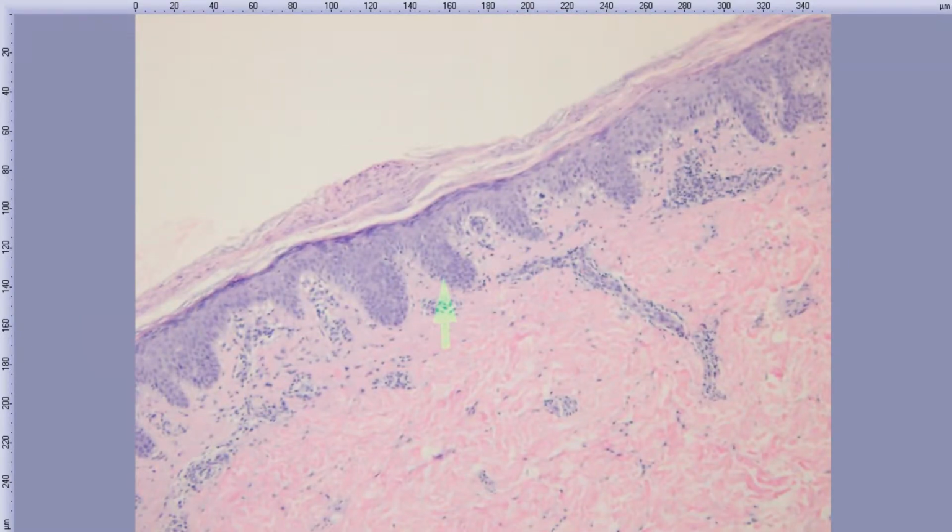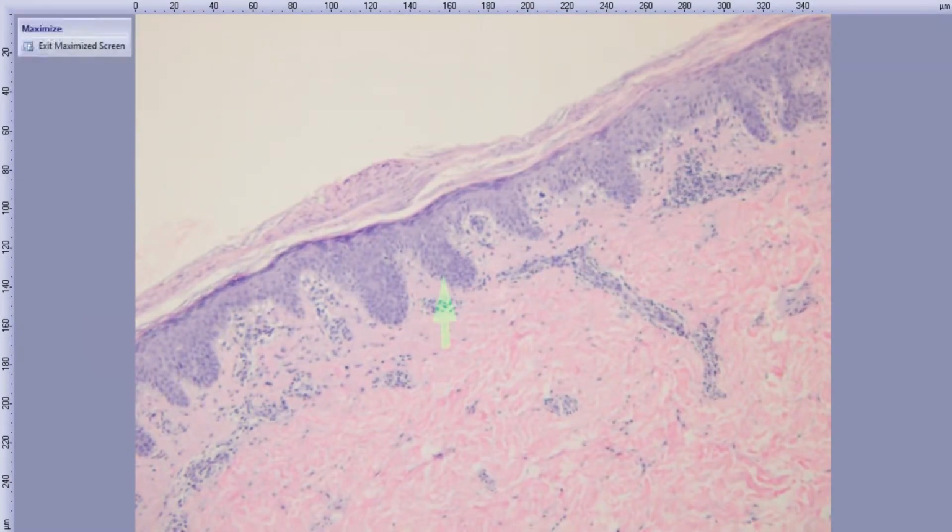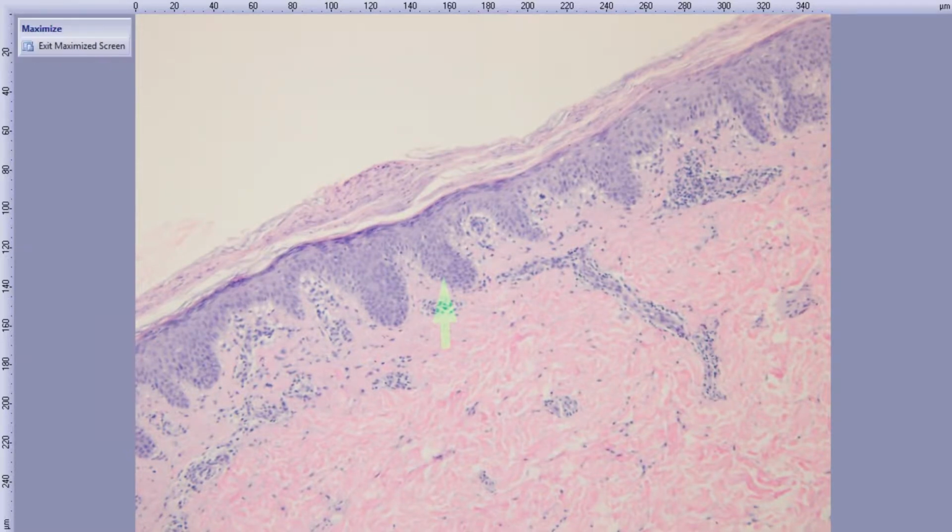Interface dermatitis, we have a big differential for that. Erythema multiforme is an interface dermatitis, but I don't like the stratum corneum for EM because this has some chronicity to it. Usually with EM, you have a normal basket weave. And for connective tissue disorders, we'd like some mucin. If it's really lupus erythematosus or dermatomyositis, rather than this plate of parakeratosis, we'd see maybe some hyperkeratosis, maybe compact. So it fits most with that.